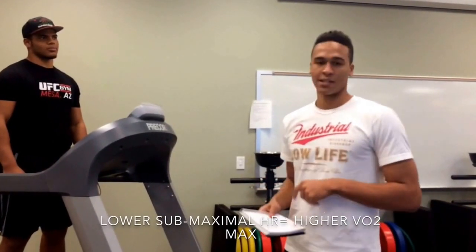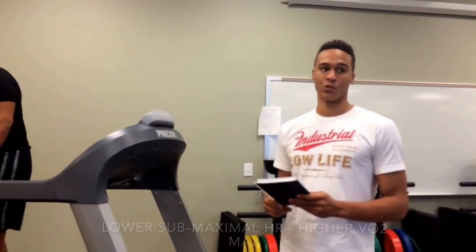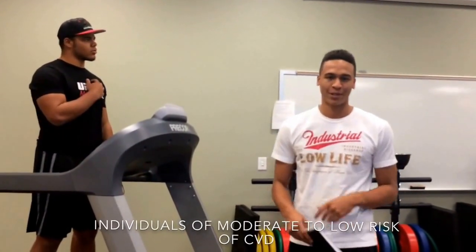This test is appropriate for non-sedentary individuals and also non-highly fit individuals. This test is also for those with a moderate to low risk of cardiorespiratory disease.